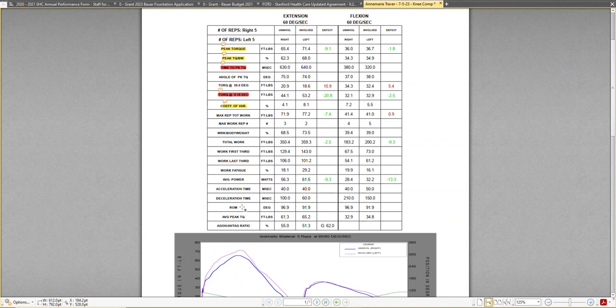One, their peak torque may be artificially dampened because they can't get that pre-stretch in the plantar surae or triceps surae, and we would also pick that up in their angle of peak torque, which would give us some indication of this.